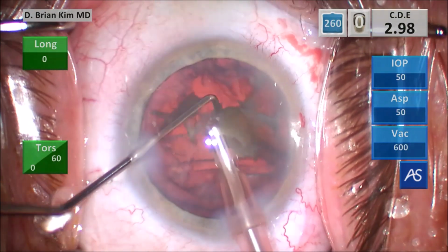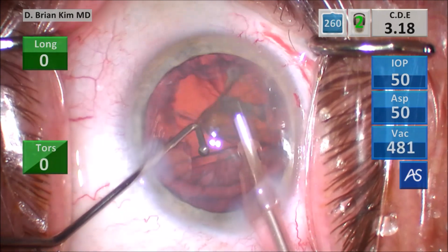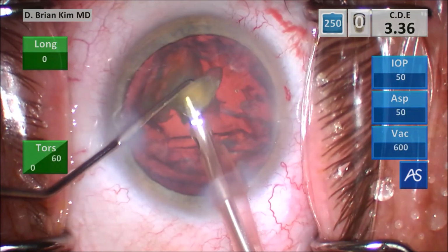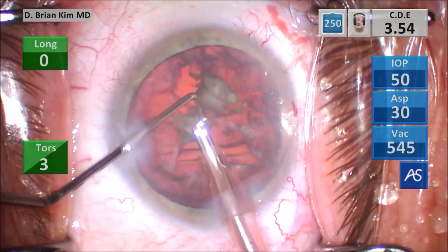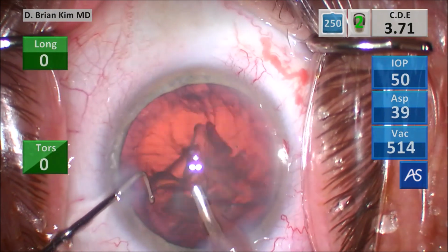So that's the thing. Most people, the way we're taught, is never place that phaco tip deep in the bag. Don't do that. Well, why? That's because most people think about the phaco tip as a machine that uses vacuum and ultrasonic energy. But if you don't use ultrasonic energy or vacuum at that moment, you're not using it as that. You're using it as a chopper. That's why it's called double chop. And so you can place that phaco tip deep in the bag very confidently, since you're doing it for a different purpose, and you're able to fracture the lens much more efficiently.